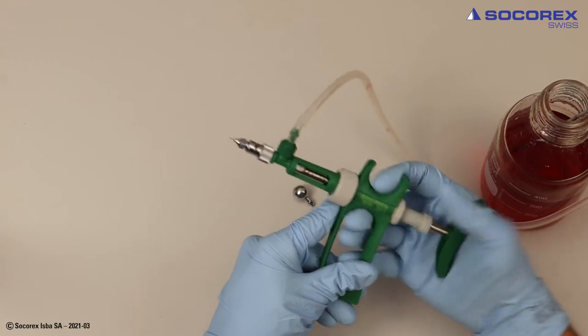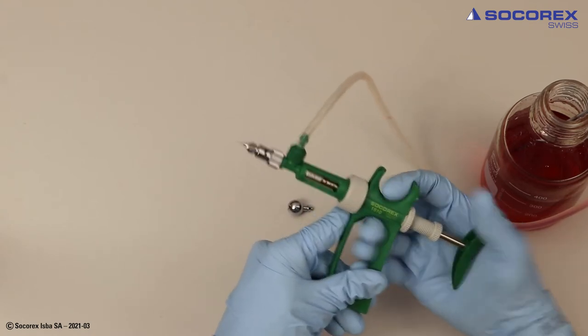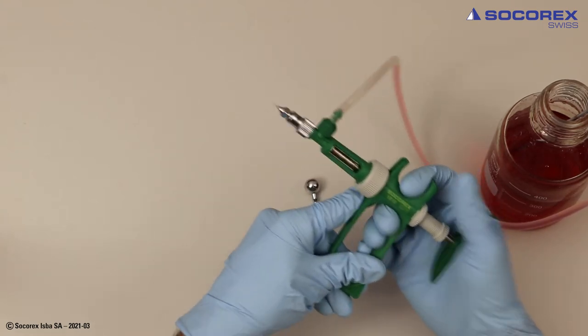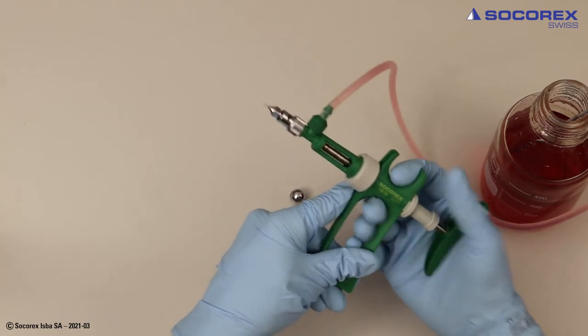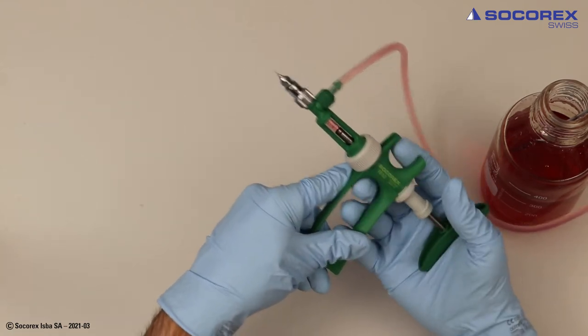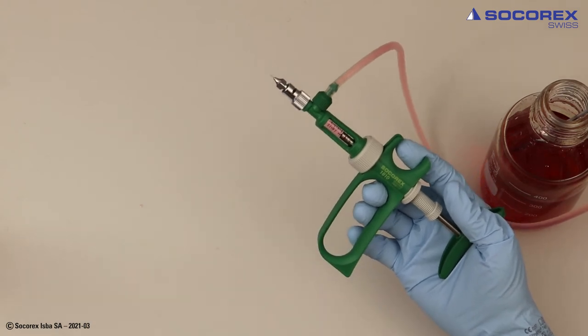Now prime tube and glass cylinder until vaccine comes out of the needle. Then eliminate any air bubbles remaining in the glass barrel.